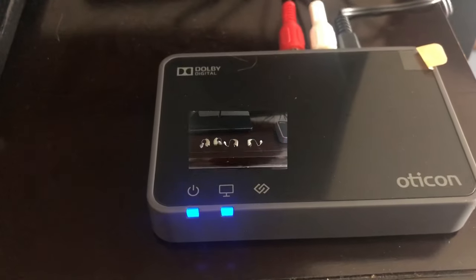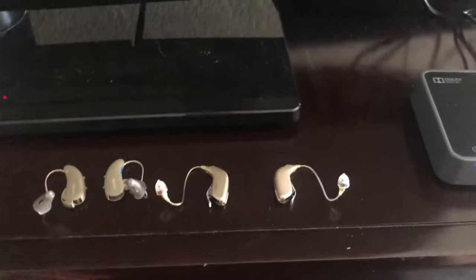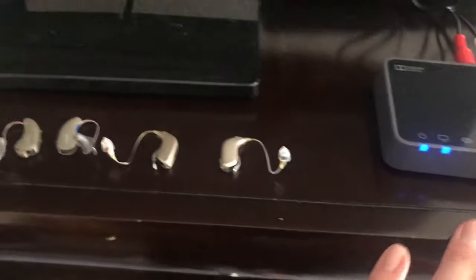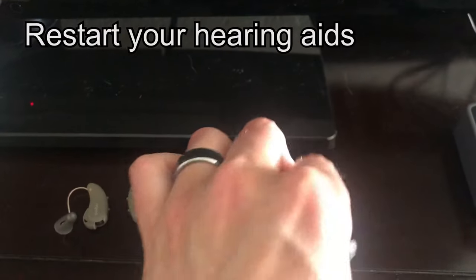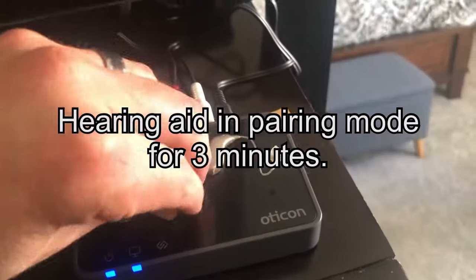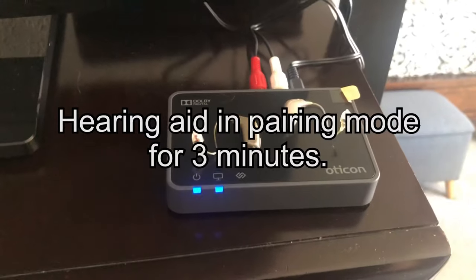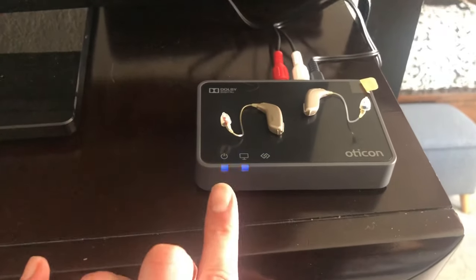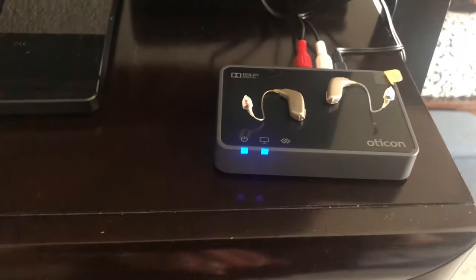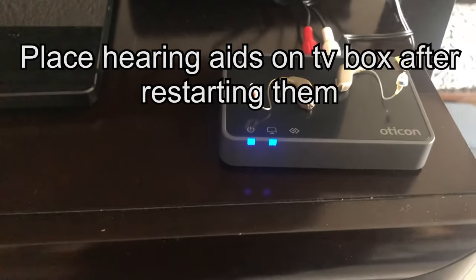Next is setting up and pairing the hearing aids. If your hearing aids are Bluetooth, the next crucial step is pairing them to the TV box. Power on the hearing aids — you have three minutes to pair them with the device. For this style, just set them on top of the box. Watch the light, and it will change color once they're paired automatically. Once it goes solid, that part is complete.